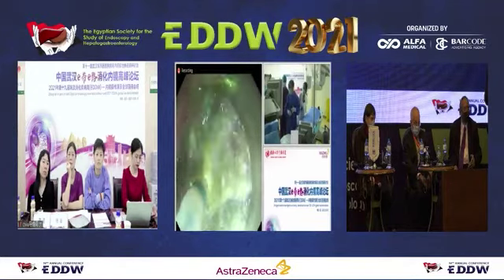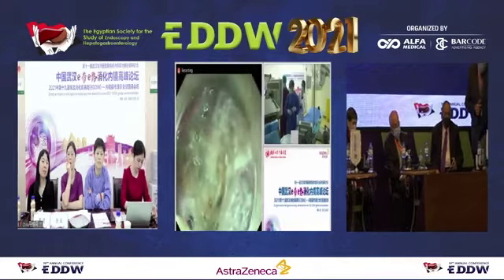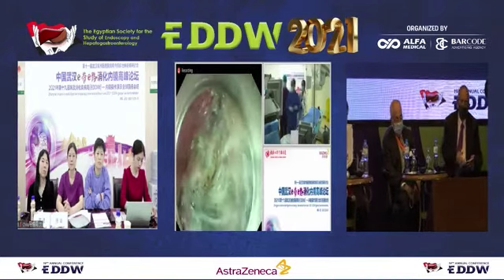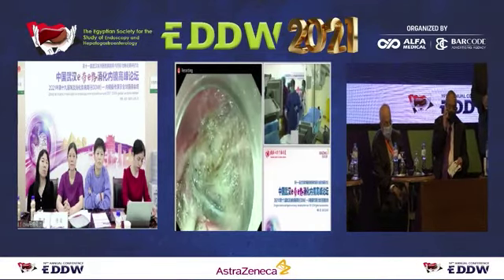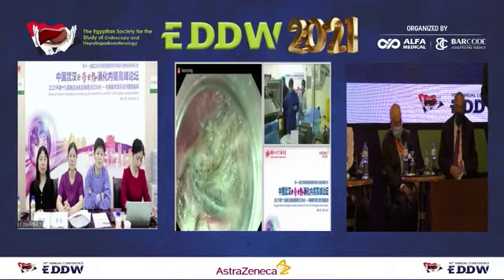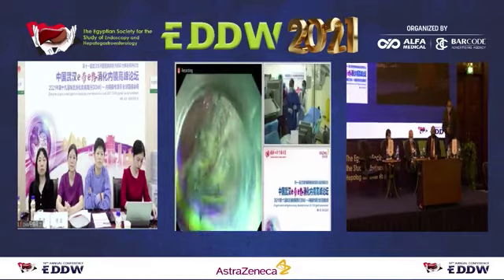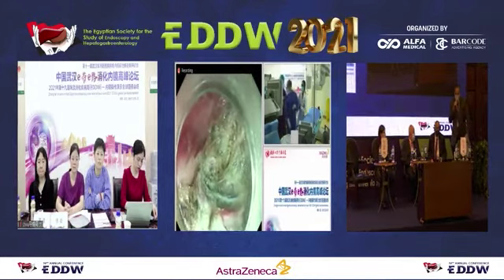So, how common are perforations in your experience doing POEM? The incidence of esophageal perforations? I think usually we don't care whether it's a perforation or not, because we usually do the full thickness dissection. We think this is more effective for the patients. After the operation, the patients will not present the stricture anymore. You can see we do the full thickness dissection, not just the upper layer.